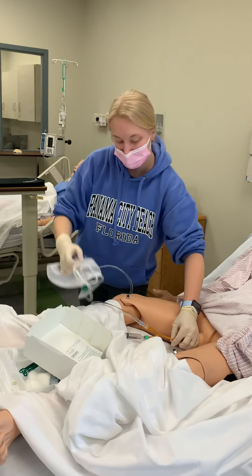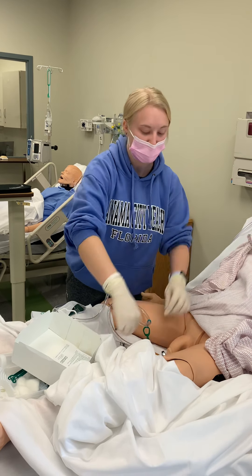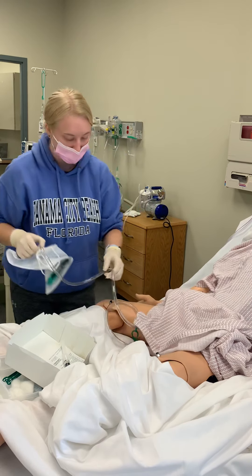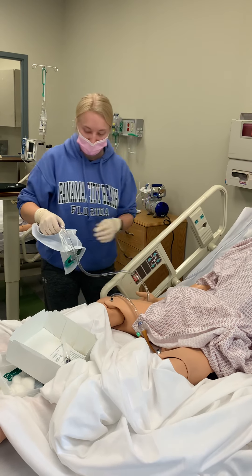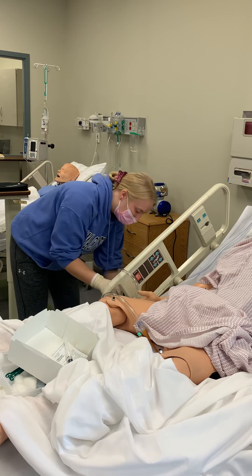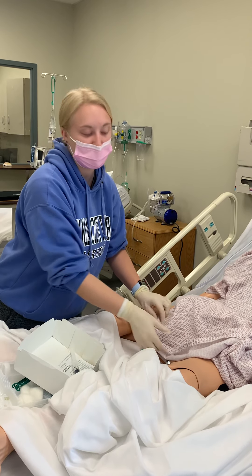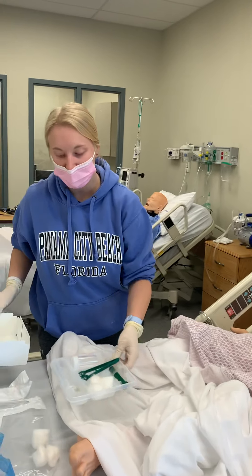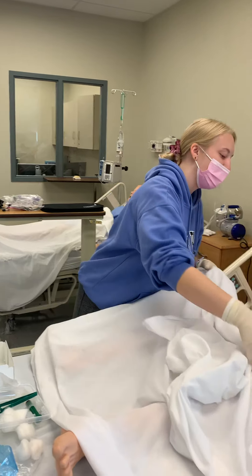Which I can do in just a second. Leave that there for just a second, and then go ahead and do that. And I would go ahead and hook this up, and go ahead and hook this to the side of the bed. And if I had a leg strap I'd go ahead and attach it to the leg as well. And that completes that. I clean up my area as well, and then make sure the patient is comfortable. How are you doing, Mr. Everett? Good?